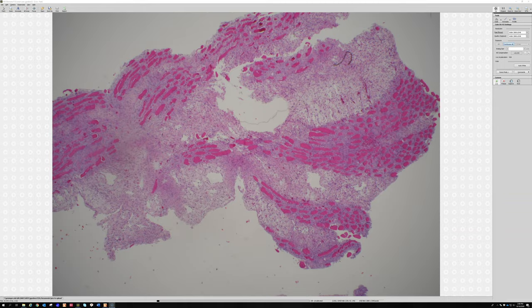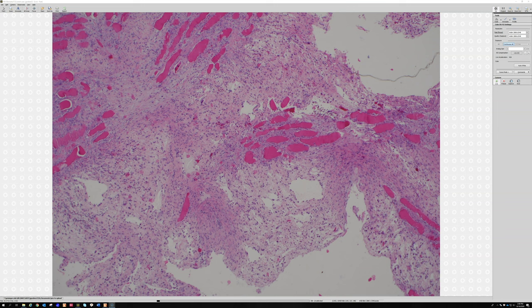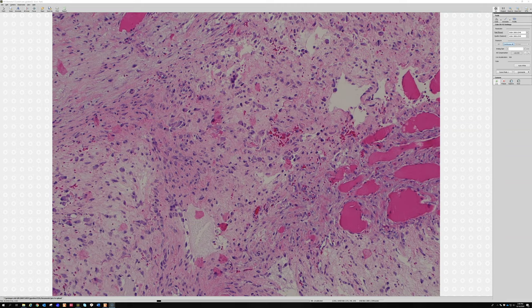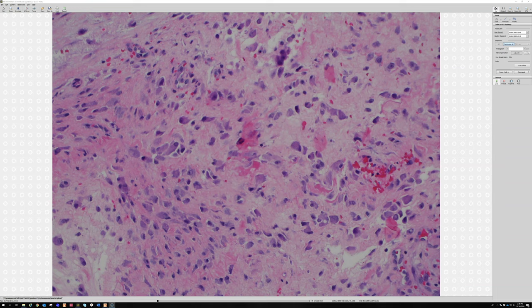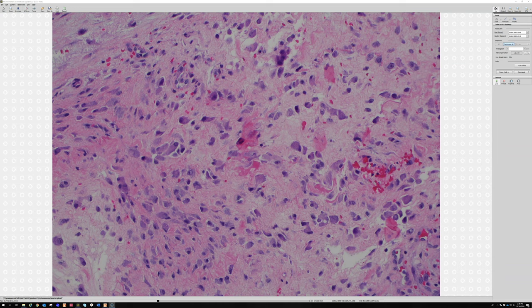All of these weird benign things that can look malignant are important pitfalls to learn about in practice. You can see some myxoid cystic degeneration and focal breakdown, just like in nodular fasciitis, and here's another pocket of those ganglion-like cells. The hypocellularity also helps — the cells are spaced out, whereas in most sarcomas the cells are packed close together. An exception can be some forms of myxofibrosarcoma, where cells float in a myxoid background, and those cases can be quite challenging.